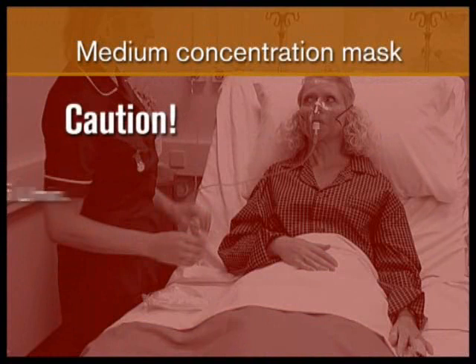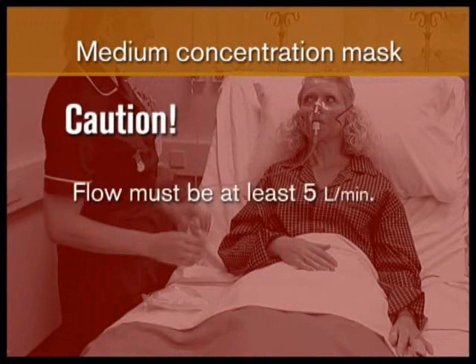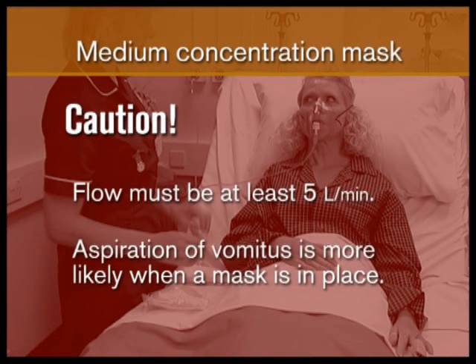Caution: flow must be at least 5 litres per minute to wash CO2 out of the mask and prevent rebreathing. Aspiration of vomitus is more likely when a mask is in place.